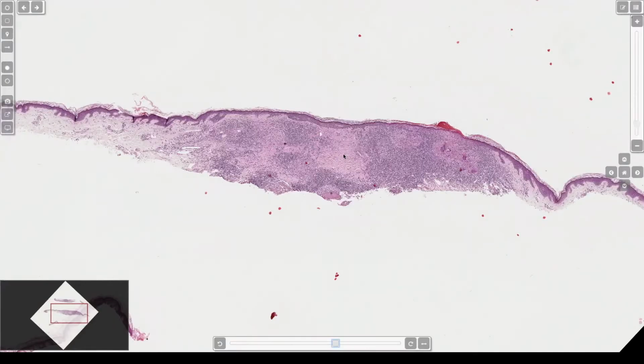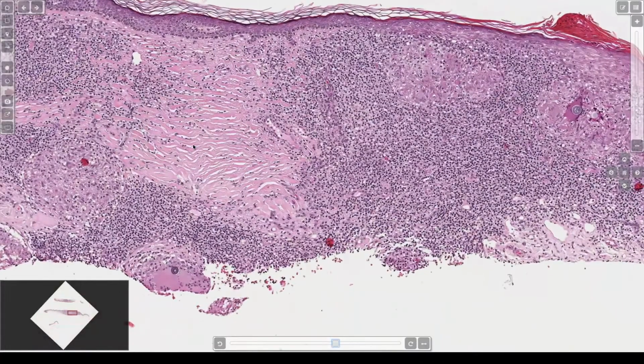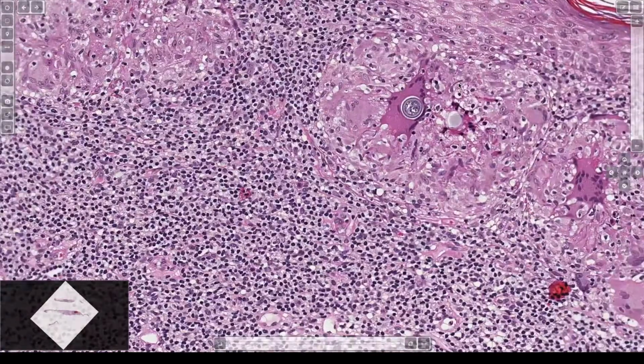That's why they look more pale, because the nuclei are spread out from each other by extra pale cytoplasm. So that's a kind of useful low power way to start thinking about histiocytes. And when I was wrong. Look, this is not actually histiocytes, it's collagen. So see, I told you, it doesn't always work. But these areas are histiocyte aggregates. And so aggregates of histiocytes are granulomas.